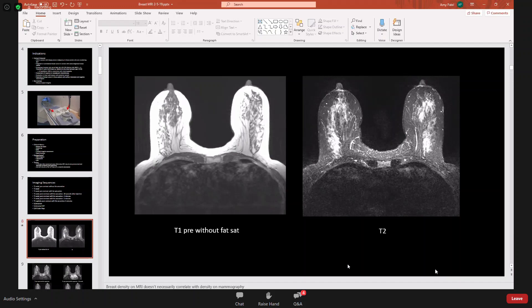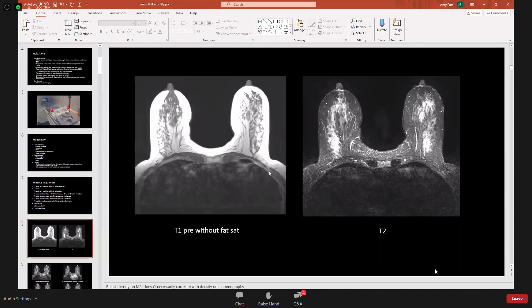Breast density on MRI does not necessarily correlate with density on mammography, and density is reported in the MRI report. On T1 pre-contrast without fat saturation, fat appears bright. On T2, fluid-sensitive structures such as cysts and vessels will light up. These sequences are visible in the examples shown, including T1 pre without fat saturation and T2 sequences.